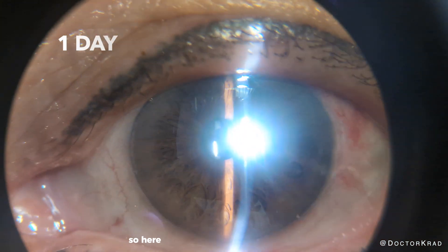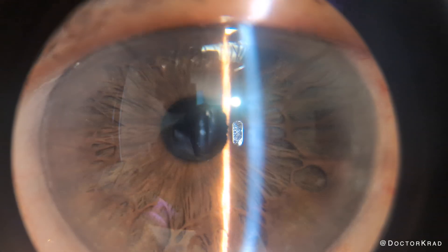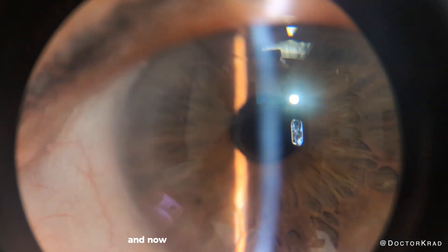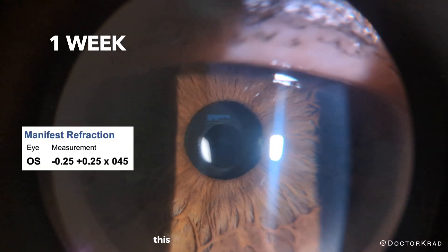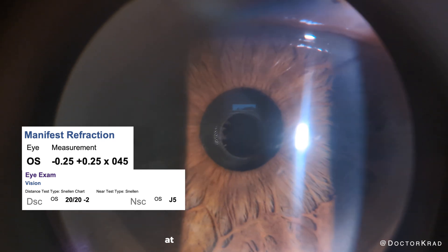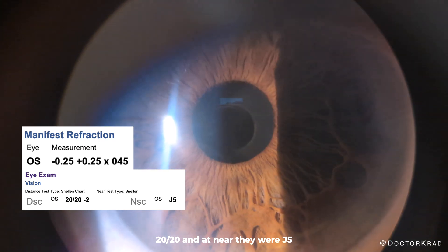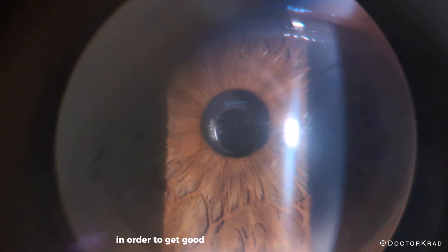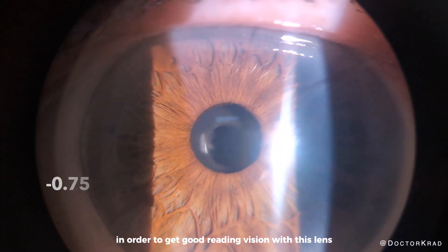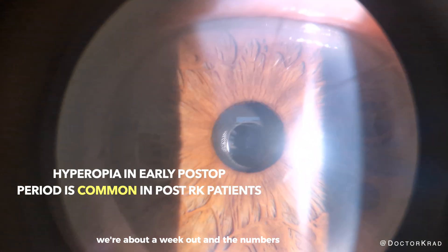Here is the patient one day after surgery — the cornea is looking good and the lens implant is centered. At the one week post-op visit, at a far distance they were 20/20 and at near they were J5. Bausch + Lomb typically recommends targeting around minus 0.75 to get good reading vision with this lens, and that's what we did. We're about a week out and the numbers can still change.